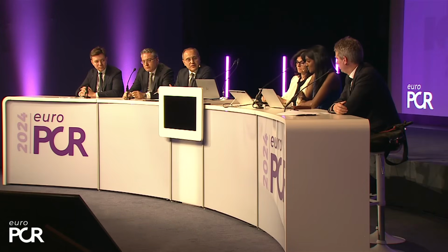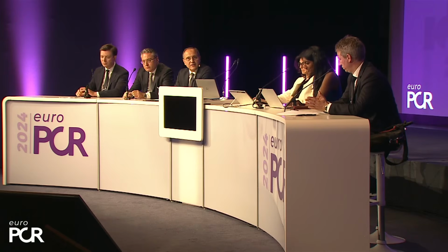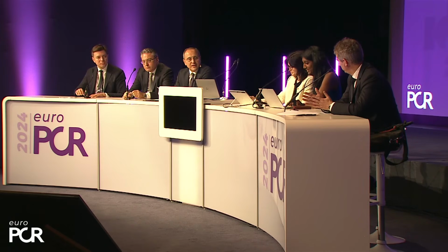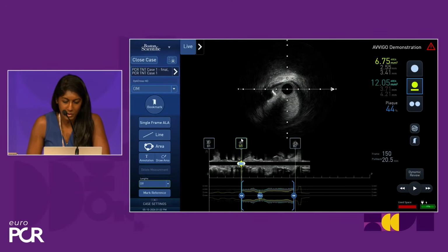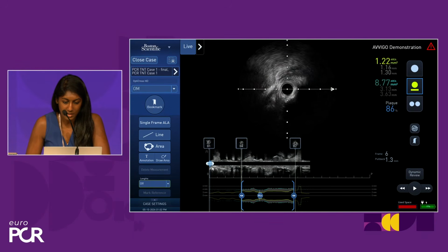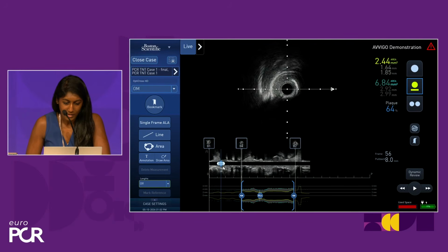How far are we in our IVUS 1, 2, 3 algorithm, Vani, in terms of IVUS assessment of the plaque modification? Are we ready to assess the stent size and length? I think you can analyze it for us. Thank you. If we could go to the IVUS live viewer again, please, tech team. Thank you. So this is actually their third pullback, but it's the most relevant pullback in terms of looking at landing zones. So if I go distally, you'll see here that this is the small OM.